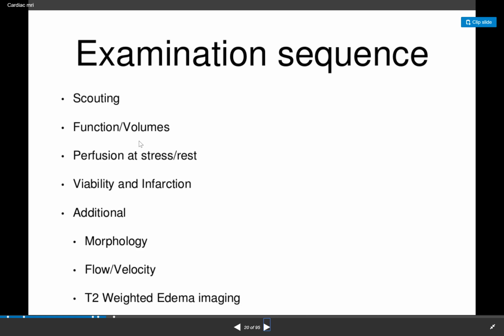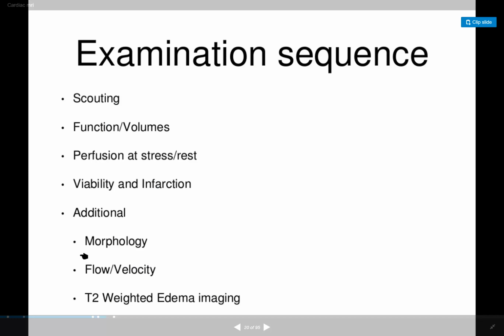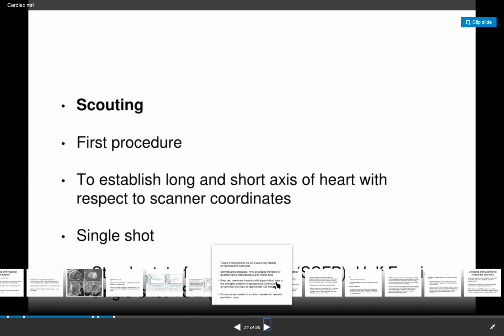Now, in the middle of this functional and the contrast imaging, we can do different types of imaging that might include flow velocity imaging. We can do some morphological imaging features, like T1 weighted, T2 weighted images, or T1 and T2 maps. So that's mainly the MRI examination sequences. So scout films, then blood imaging, then functional volume imaging, then contrast imaging, and we add T1 and T2 sometimes depending on what we are getting.